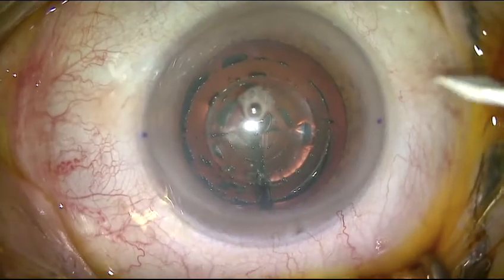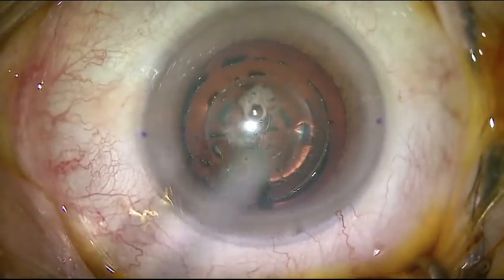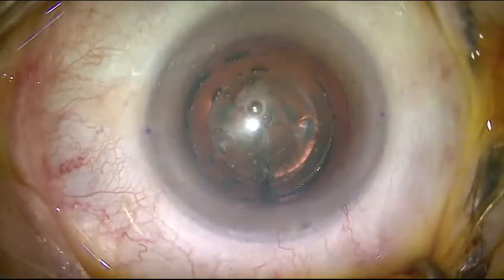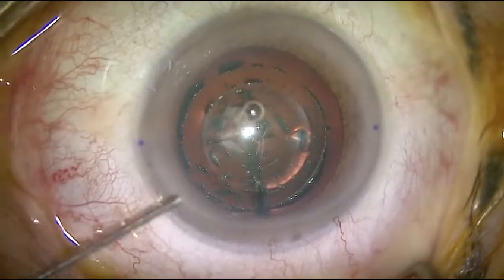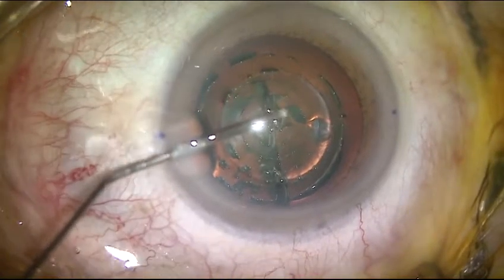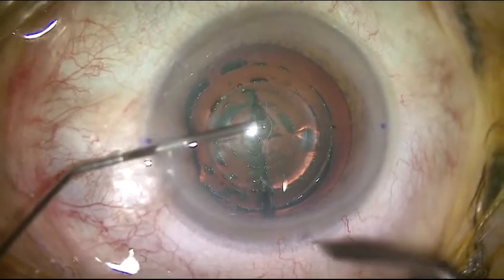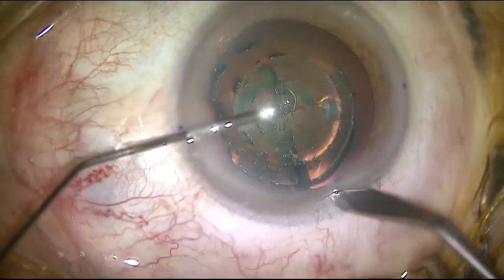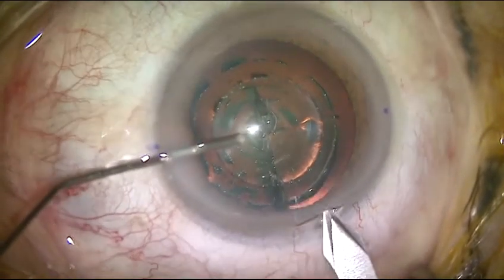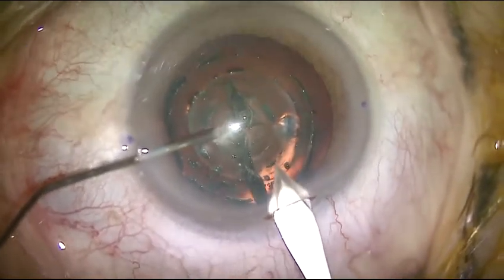To correct 0.75 diopter of astigmatism, followed by paracentesis at 0 and 180 degrees, viscoelastic, and the main incision of 1.8 mm. It's a 3-step incision to make sure it is watertight at the end of surgery.